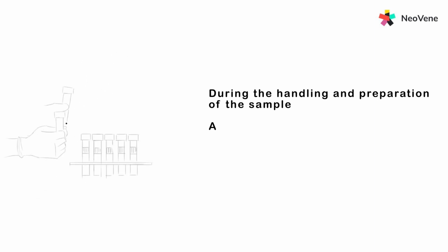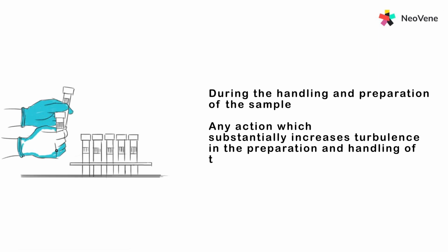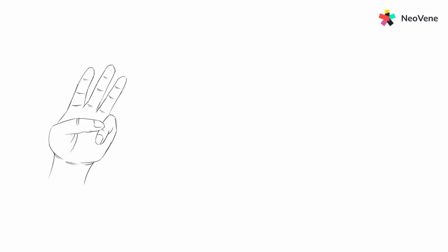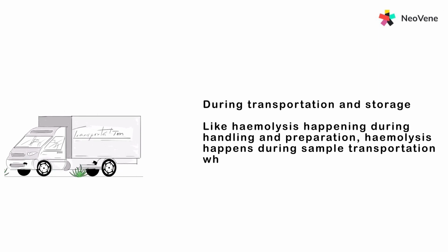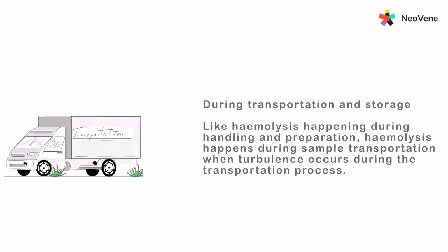During the handling and preparation of the sample, any action which substantially increases turbulence may cause hemolysis. 3. During transportation and storage, like hemolysis happening during handling and preparation, hemolysis happens during sample transportation when turbulence occurs during the transportation process.